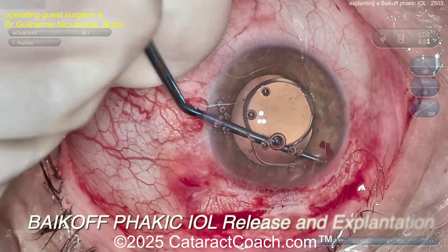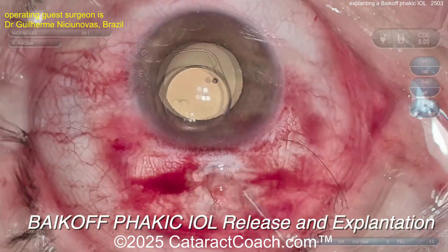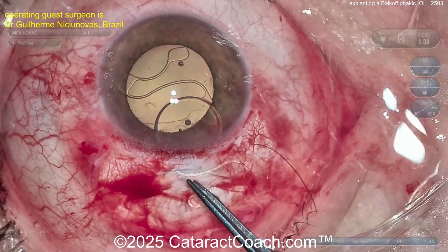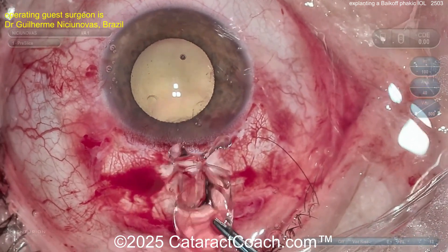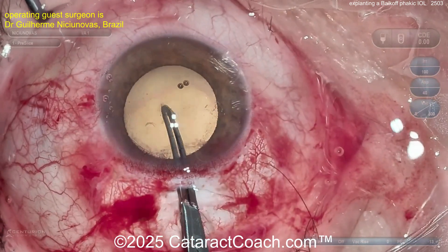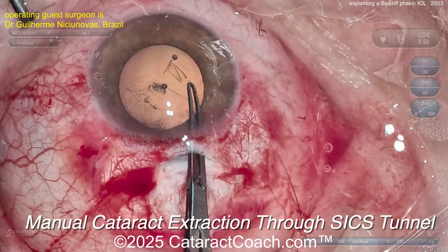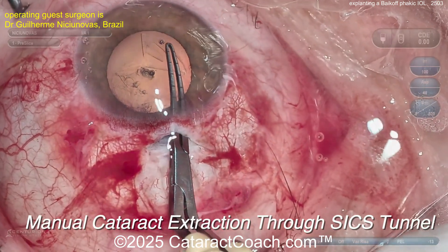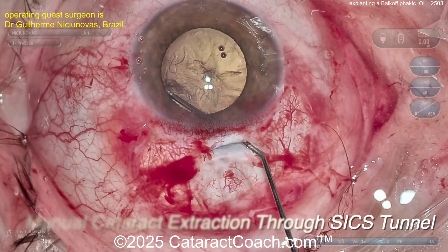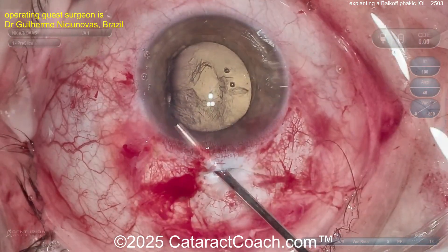Save that in a museum — this is an ancient lens. This Baycoff IOL, this phakic lens — I've never even seen one. Pulling it out of the eye nice and easy. Other companies even tried to make phakic lenses for the anterior chamber. Alcon made an Alcon Cachet lens — the same concept, made of acrylic material designed for the anterior chamber. They did some U.S. FDA trials, eventually deciding not to release it on the U.S. market. The complication is that patients who get these phakic IOLs, especially anterior chamber phakic IOLs, can have corneal endothelial cell loss at a few percent per year — sometimes even more. Even posterior chamber phakic lenses are associated with slow but steady endothelial cell loss. The eye is finicky; it doesn't want anything in there.